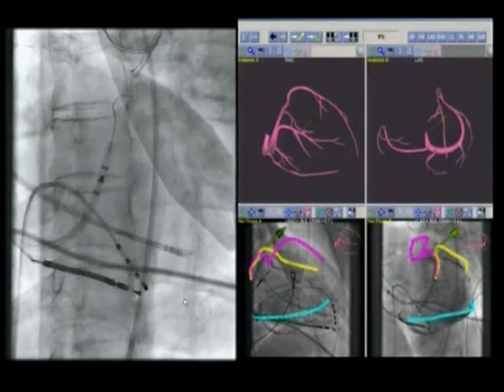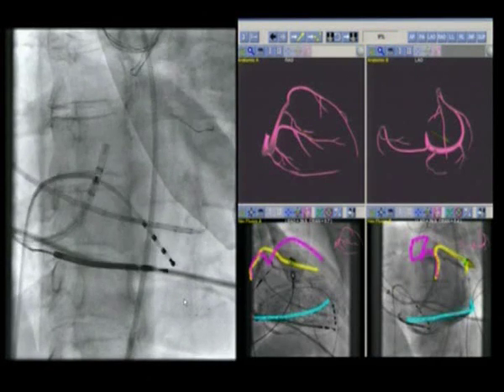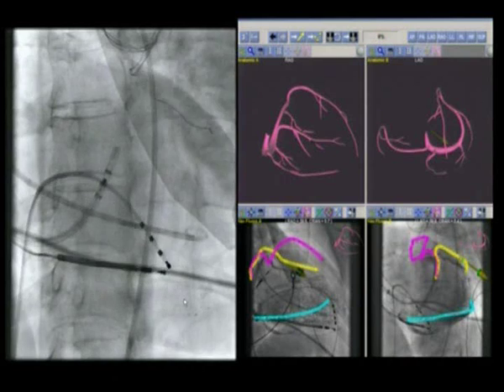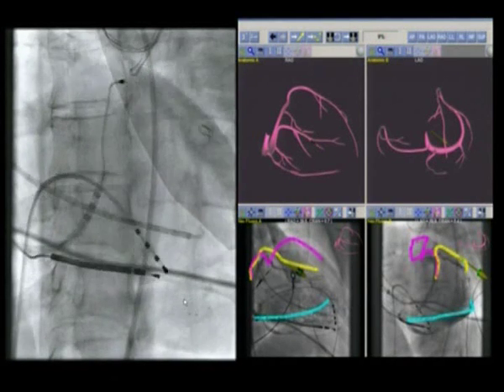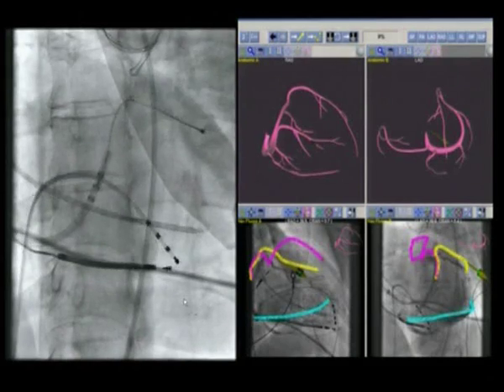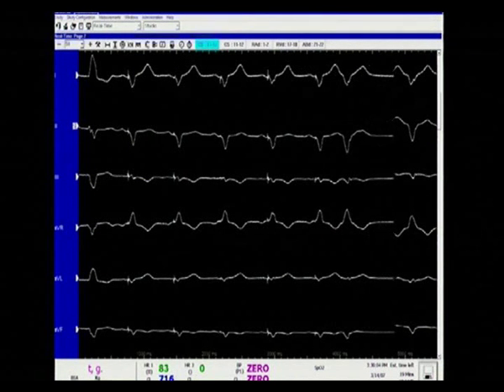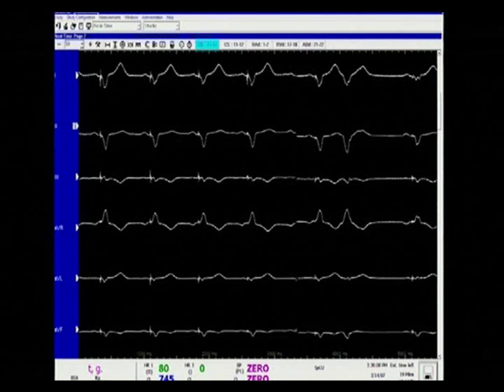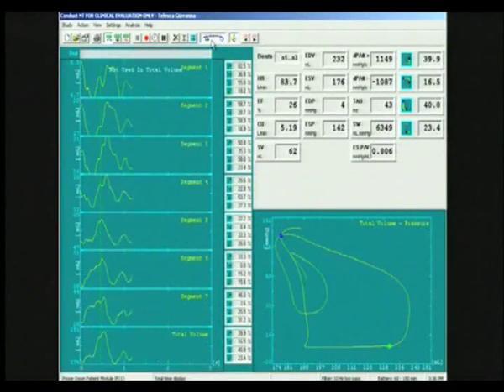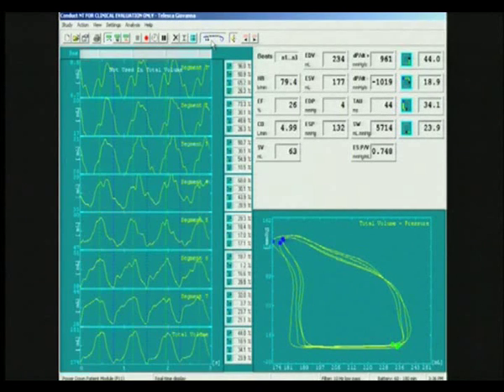After analyzing all previous data, we conclude that the best hemodynamic site is the first targeted location in the lateral branch of the coronary sinus. The system stores previous venous approaches, facilitating return to the best lead location. This function allows us to move away from sites with optimal hemodynamic response without fear of not being able to return if that site is later shown to be the best. Pacing from the left lateral branch again results in Q waves in lead 1, and the pacing position appears stable. The data clearly show an acute improvement in mechanical dyssynchrony resulting in enhanced systolic function, with increased stroke volume, increased dP/dT and stroke work, and reduced diastolic pressure.